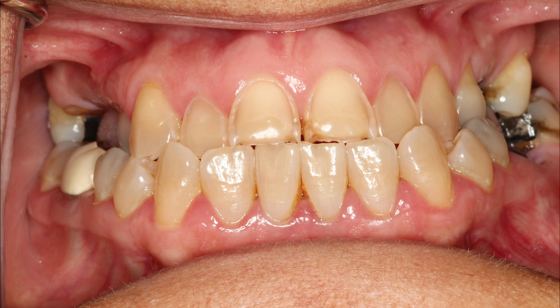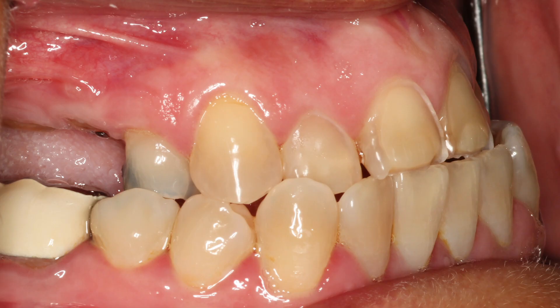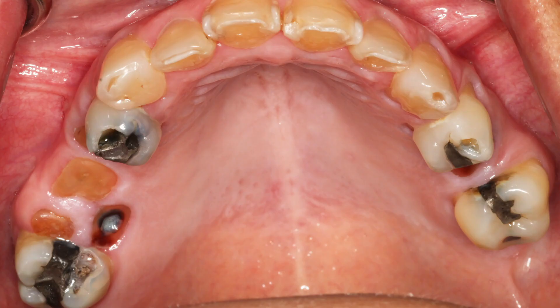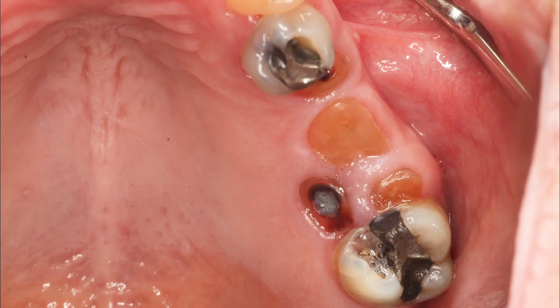This is the consultation I saw this morning. You can see she's got kind of a Class III going on, a crossbite, and a few missing teeth with broken root tips. In general she just wants to replace the missing teeth — she even wants an all-on-four for the upper arch. I use my fingers to evaluate the thickness first and check the mobility on the teeth.